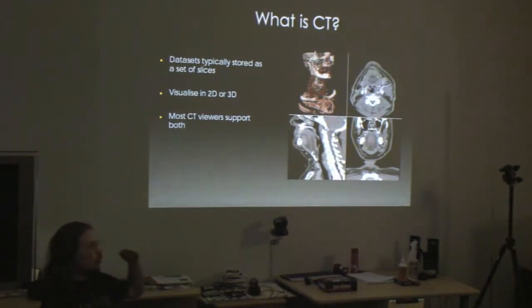You would have slices, say, through a head, like so. But of course, you can also slice in different directions, so like that, or like that. And finally, which is the new approach, that's the three-dimensional visualization. And most viewers which you can get, so all commercial and free viewers would normally support views like that. And of course, I'm studying visualization of this sort.